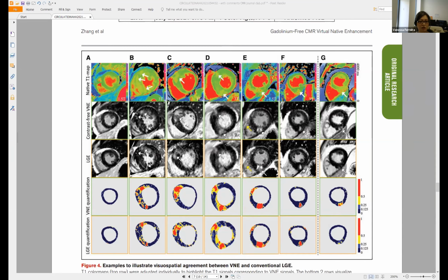Are they looking at the anterior wall or the inferior wall? How are they doing this? So it's not so much a black box where you throw something in and then it spits something out and you don't know what happened in between, and there's no audit trail. And audit trails are really important for clinical applications.